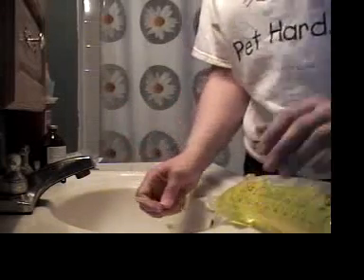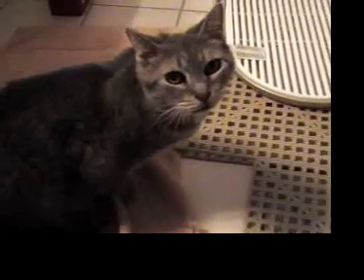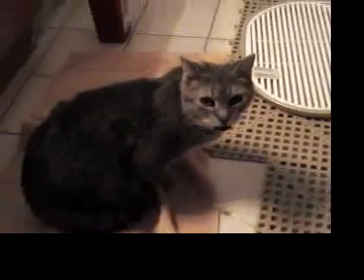Now I'm going to go get the cat. This is Afer. Afer's about 19 years old. She was diagnosed with kidney disease about 3 years ago. Yes, she's saying hello. She's been pretty stable over the past 3 years, just using a wet diet, sub-Q fluids, and a couple medications prescribed by her vet. She's getting ready for her fluids.